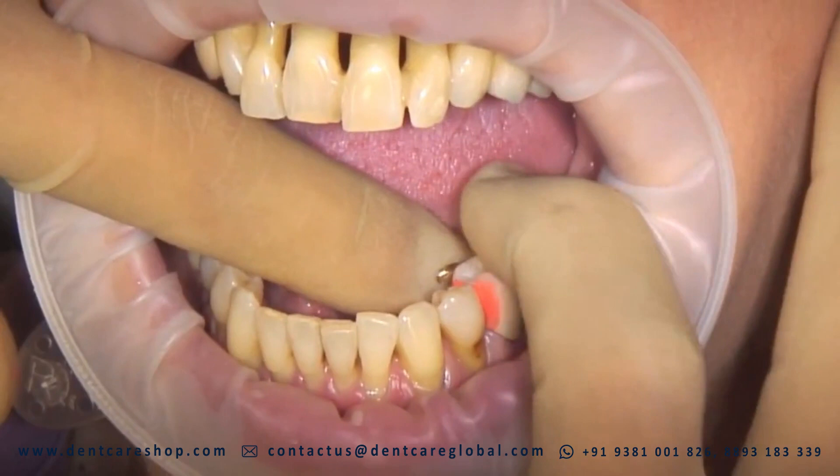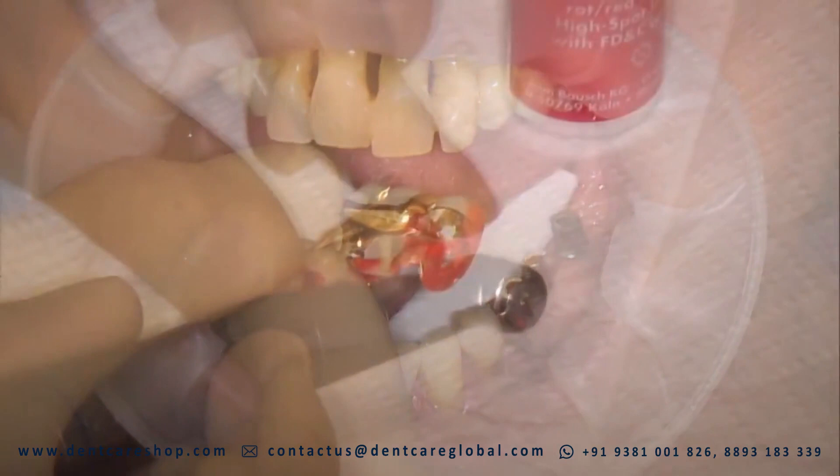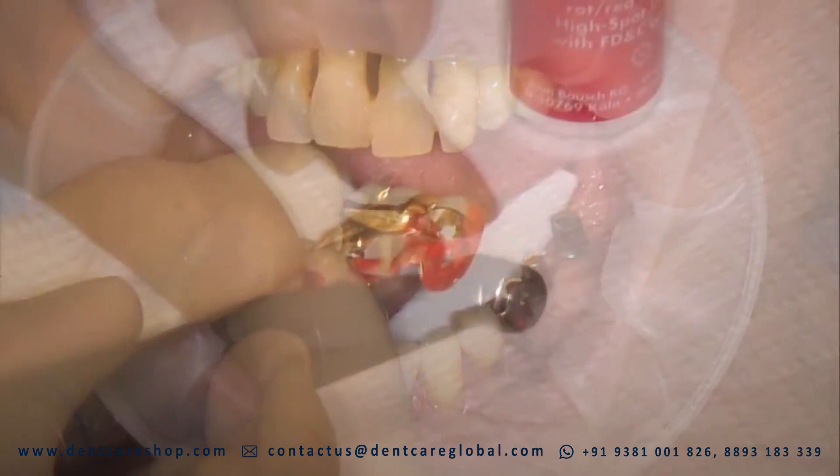Artispot can easily be removed after use. Hot water, mechanical friction, toothbrush or dental floss, alcohol, isopropyl alcohol, and steaming will also loosen residual color deposits.